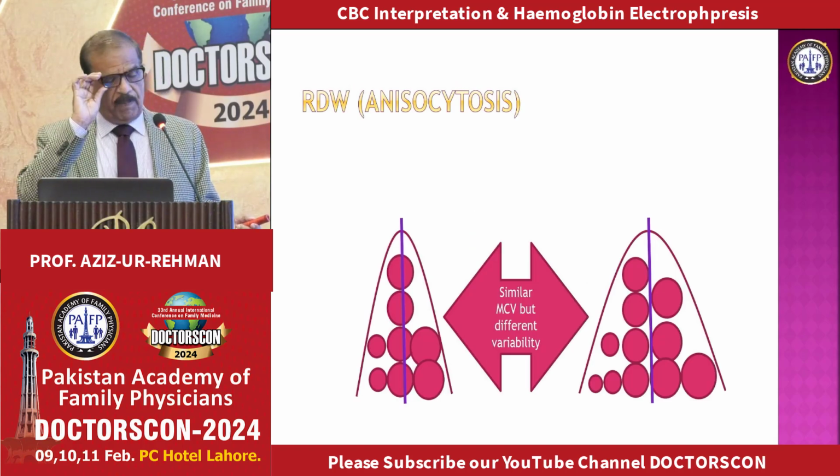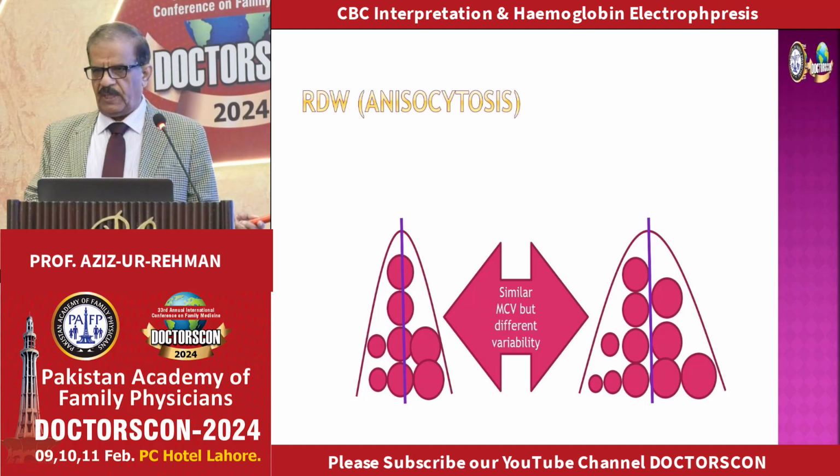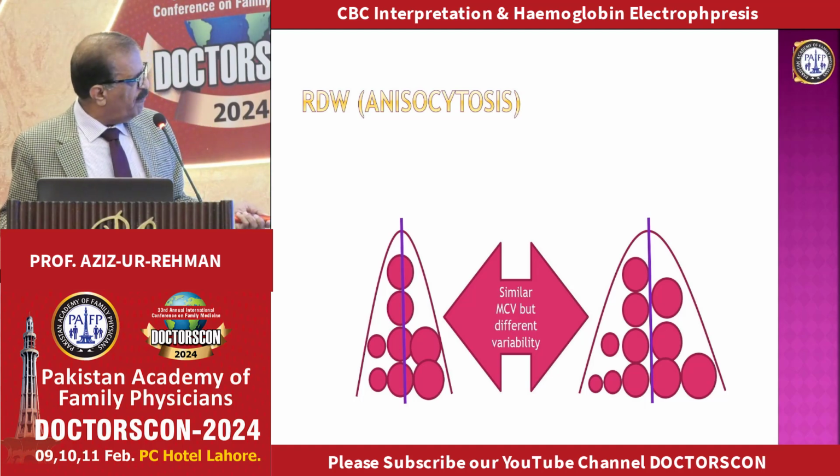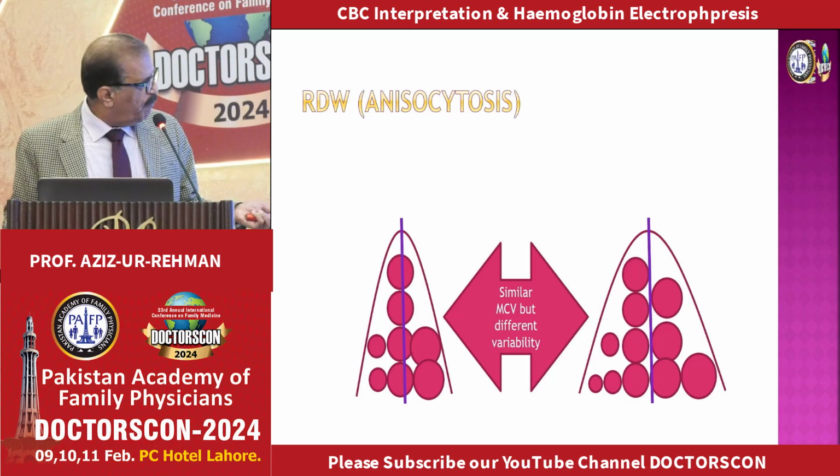Now this is an example. These are two populations of cells. Both are microcytic. And in this case, the variation within the cell is less. So the width of this graph is narrow.